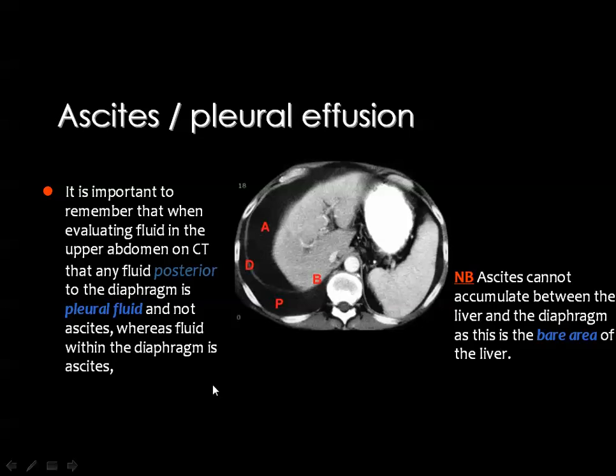Then many times in the exams the candidate is asked to differentiate between ascites and pleural collection if they coexist together.